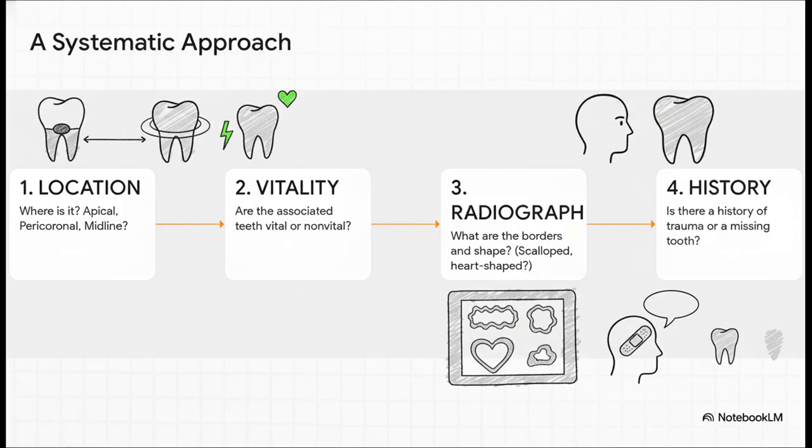Third, look at the x-ray itself. What's its personality? Is it a perfect circle? Does it have that classic scalloping? Do you see a heart shape? And fourth, talk to your patient. Get a good history. Any trauma to the jaw? Any missing teeth? Ask these 4 questions every single time and you'll nail the diagnosis.